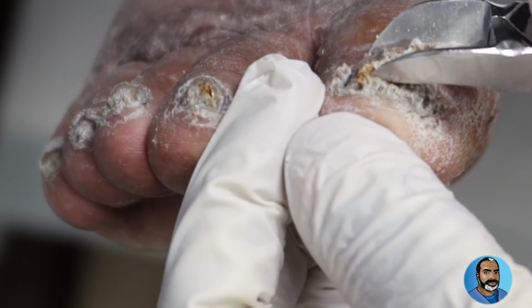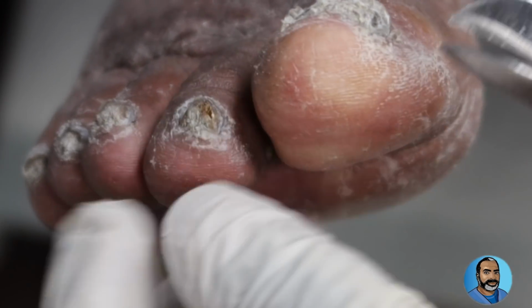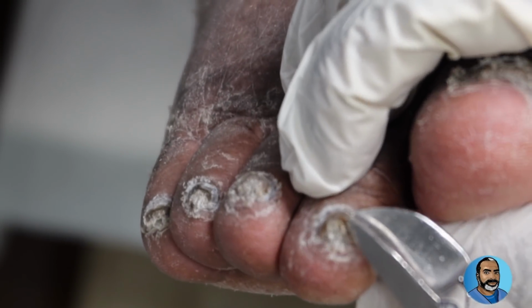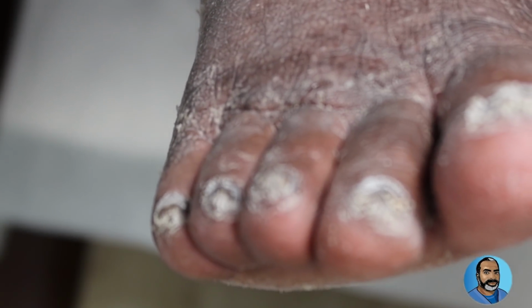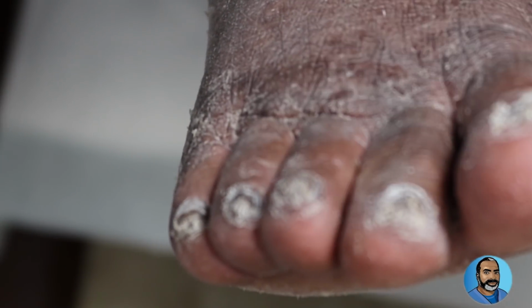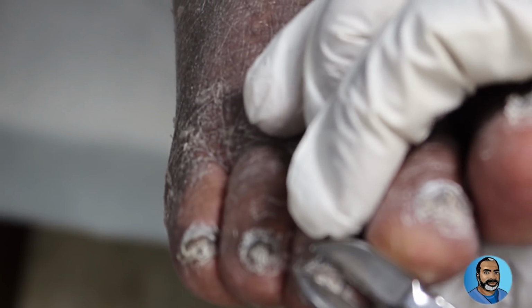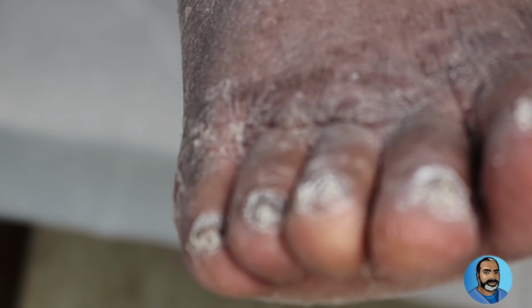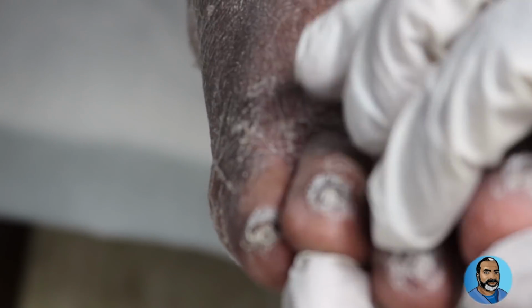Not now. Okay. So have you been trying to trim these at home? Yeah, I do. But I knew I was gonna come to you. Okay. So you can see those on that side a little bit trimmer. Yeah, I clipped those myself a little bit. But sometimes I use a Dremel to sand them down. Well, having diabetes, you definitely don't want to do that at home anymore. Well, I don't have a problem with healing and all that kind of stuff. Yeah, everybody says that until they get an ulcer. Yeah, fortunately, I haven't gotten to that level yet, but it is scary.